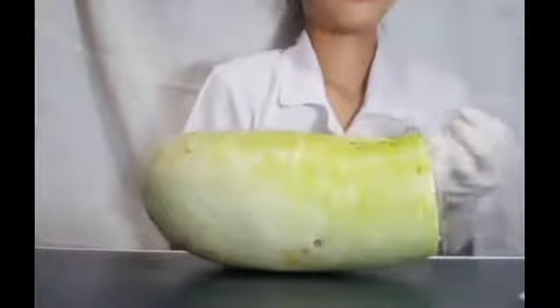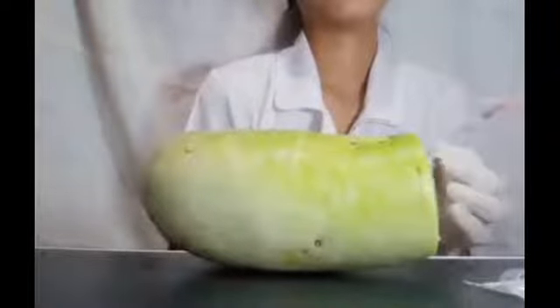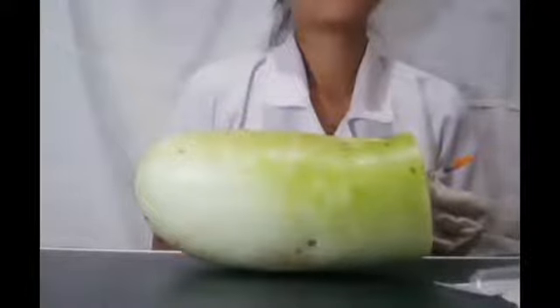Actually, this is in units, and you can see it says 100 units. So we're just going to pretend we're going to give 10 units. So we're going to get 10 units of insulin.